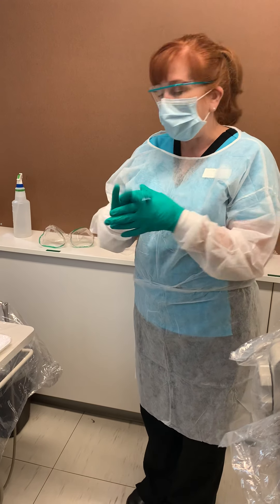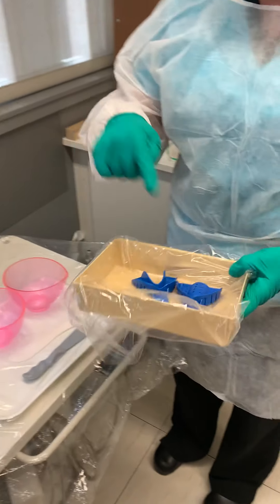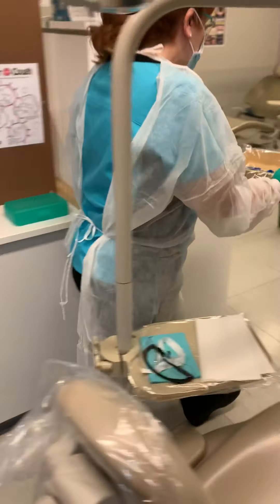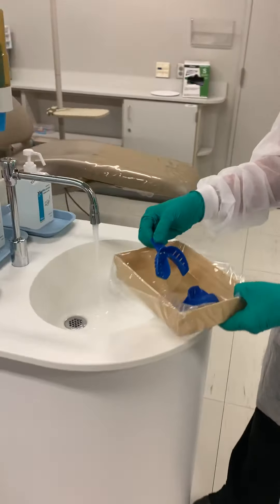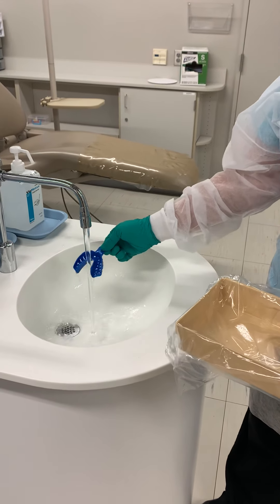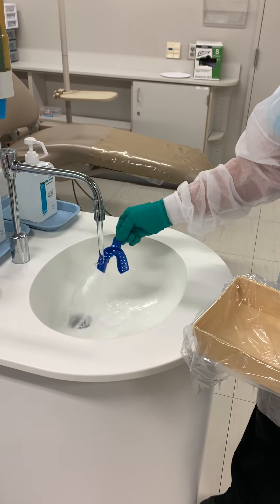After we're finished with our procedure, we've already taken impressions. The first thing we're going to do is grab our tray that will have our impressions in it, and we're going to walk to the sink. You're going to grab the impression by the handle and you're going to rinse — kind of in a downward motion so that it gets everything out of the little teeth areas.